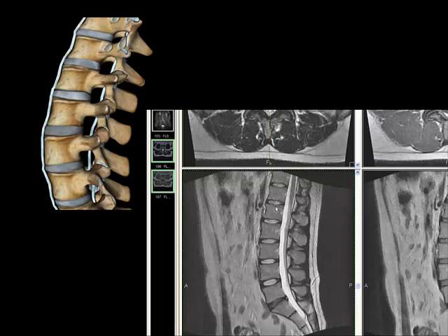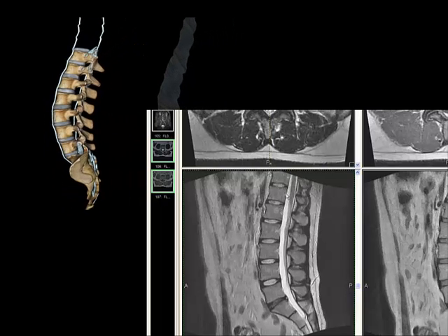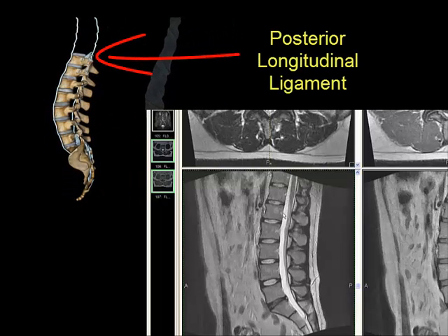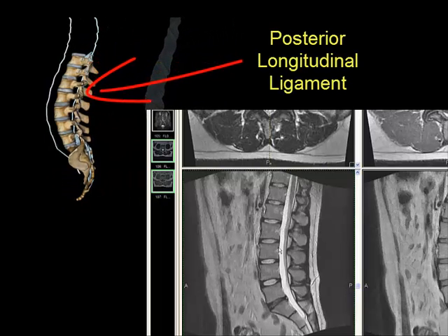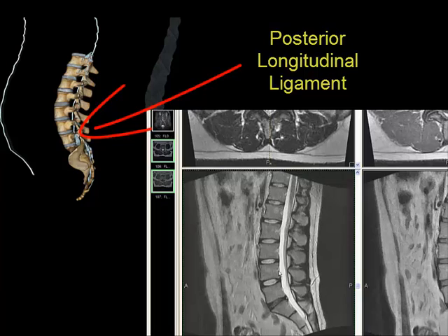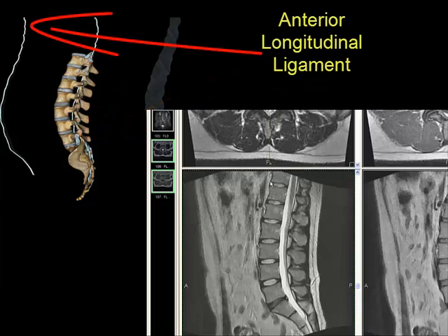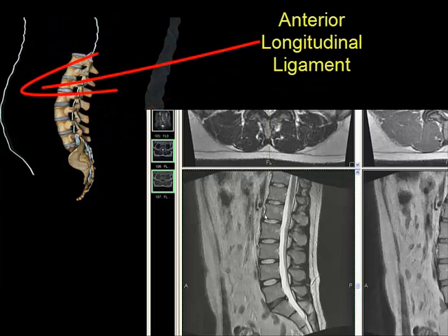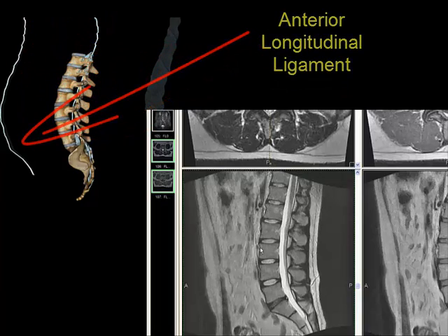Each disc should get a little bit thicker than the one before, with one exception being L5-S1, which can be a little more thin. The posterior longitudinal ligament is normally snug up against the bone and difficult to recognize unless there's an abnormality. Same way with the anterior longitudinal ligament here.